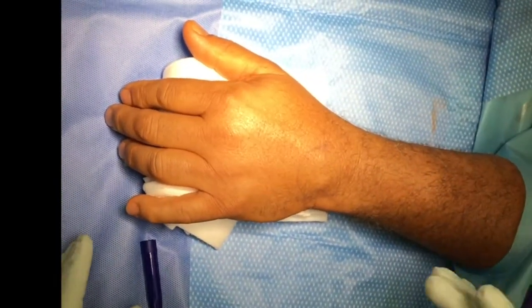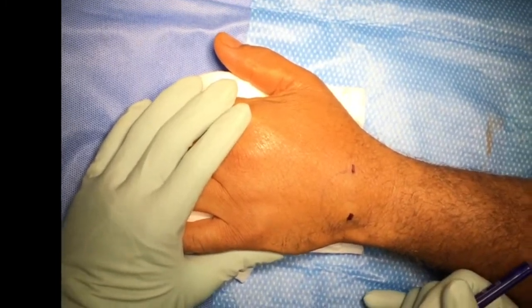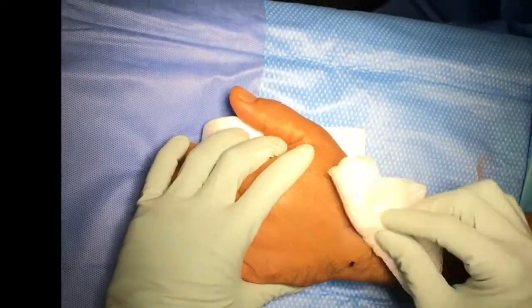What you see here is the start of our surgery, shown in a bit of fast forward to get through some of the less eventful parts. We're marking the skin, then infiltrating the area with a local anesthetic so the patient doesn't have pain, and then we set up for an ultrasound.